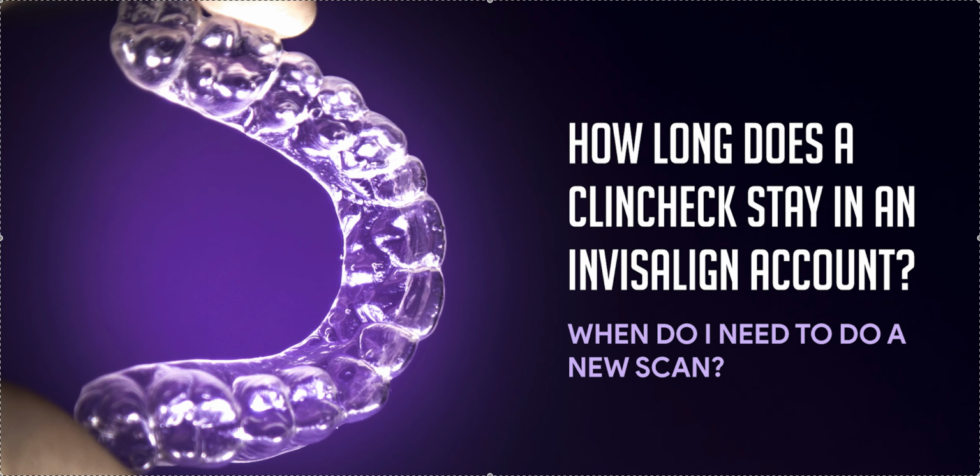It's patient records. Can't get rid of it. It exists. Now, in the real world, at least in the US, you could expunge it after 7 years, or 7 years after the patient turned 18. According to this Invisalign team member, they don't. But we definitely recommend rescanning the patient if it's been more than 6 to 8 weeks.